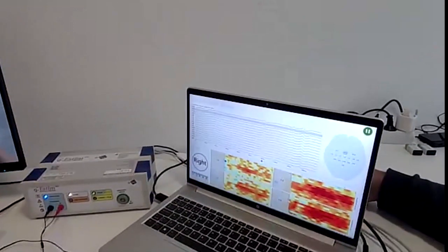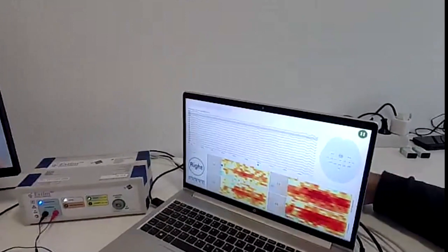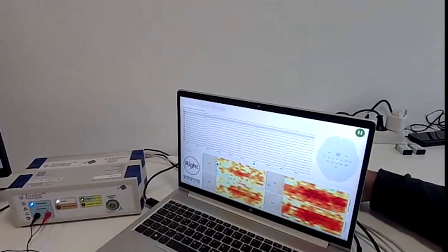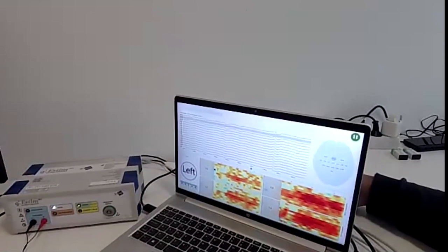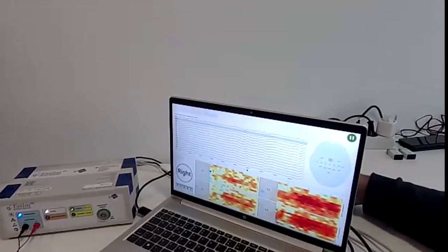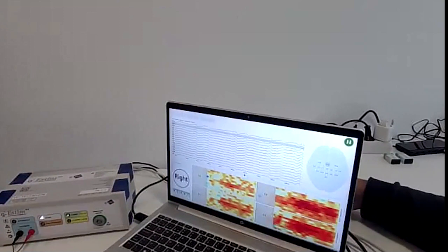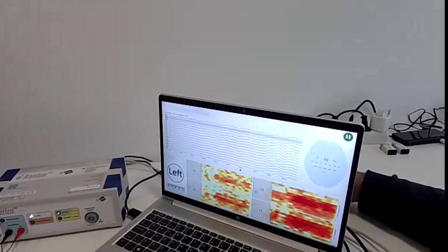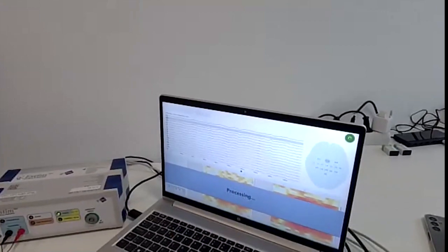Okay. Only 6 trials are missing to finish the run. Also, the ERS plots are recalculated every time, including more trials, so they get more precise. The last one, izquierda, left. You can see it here. And now it's processing.